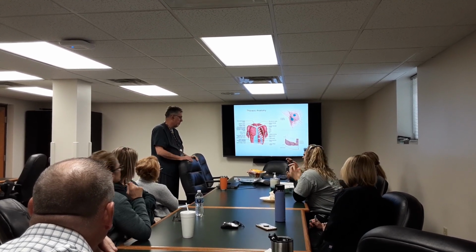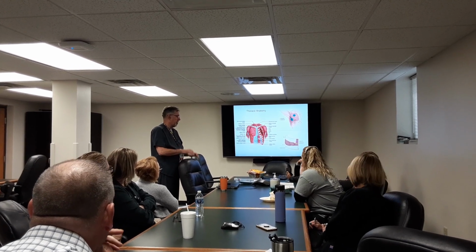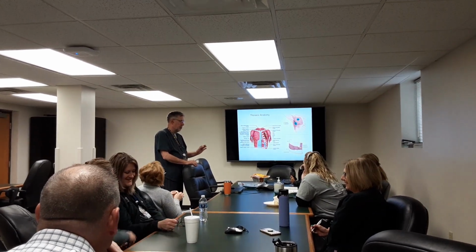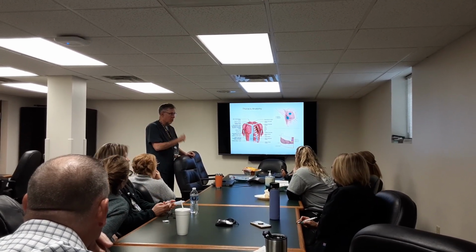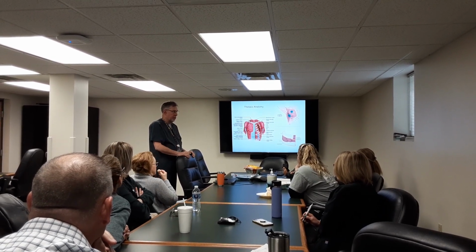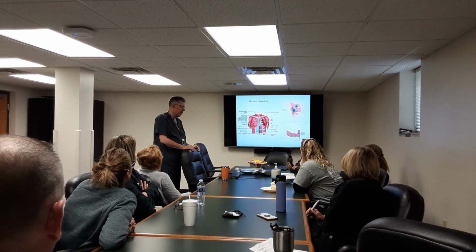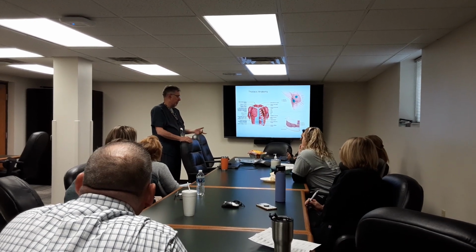So whenever you start noticing the bubbles, that means you probably went a little too far, then you got. No, that's actually the right space. That's the right space, and you'll have a loss of resistance too. What you want to do is advance just a little bit further so that it doesn't become dislodged from that space. Well, we're doing this for a pneumothorax or a hemothorax, so the lung is away from. Oh, that's true. So you shouldn't hit the lung. Yeah, you can probably advance about 2 to 3 centimeters. But if it's a complete pneumothorax, you probably have it.